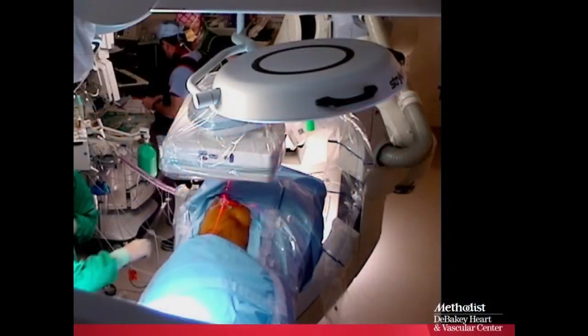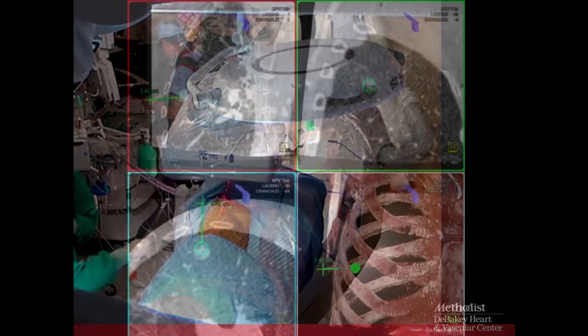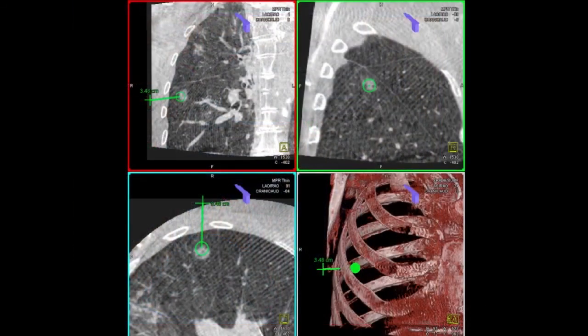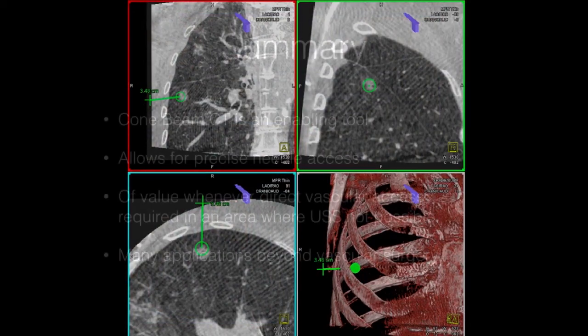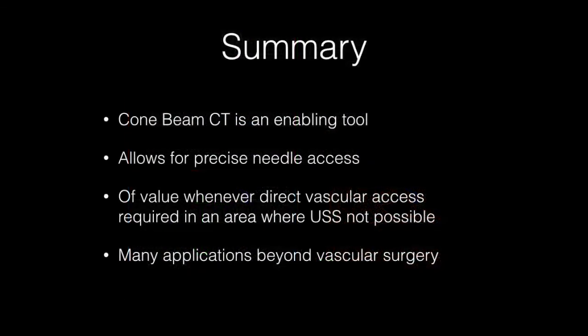We've also used this technique in other situations like lung biopsies — here we're localizing a lung nodule, and this is what the workstation looks like for that application. We dropped an embolization coil into the nodule and the surgeon then removed it. So there are a variety of different applications for this technology.